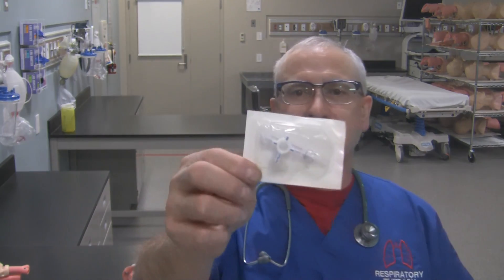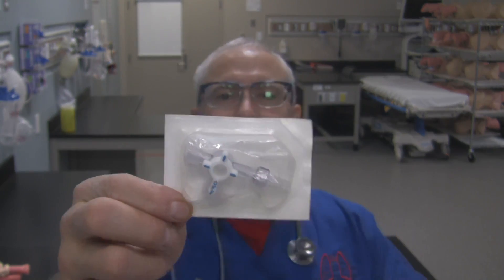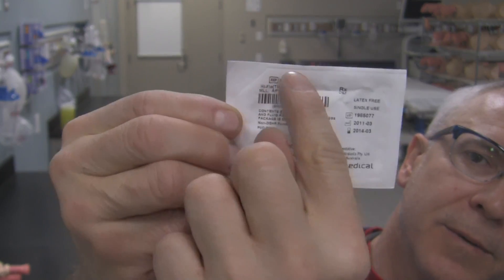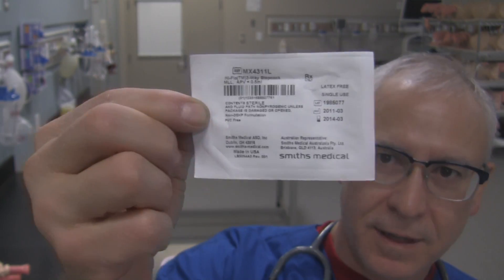This is what a three-way stopcock is going to come in — packaging like this. And at the back of the packaging it's going to tell you exactly that it's a three-way stopcock, a high flow, in this particular case, three-way stopcock.